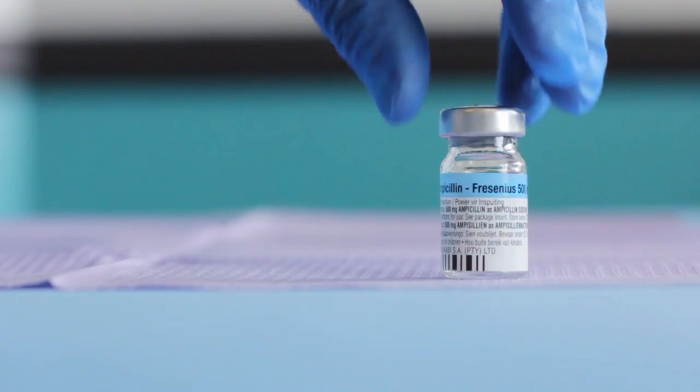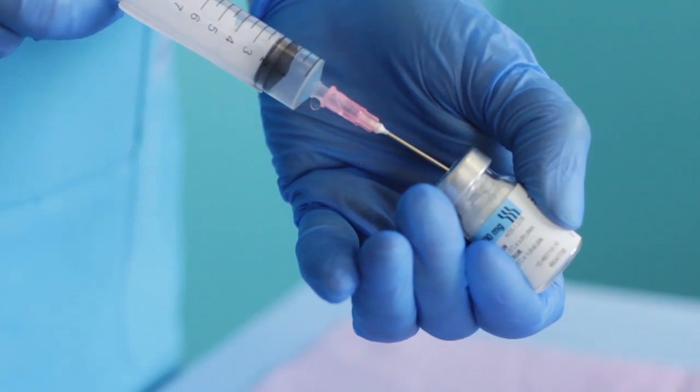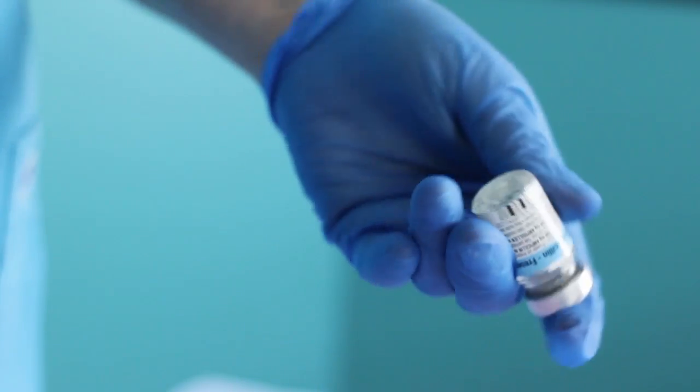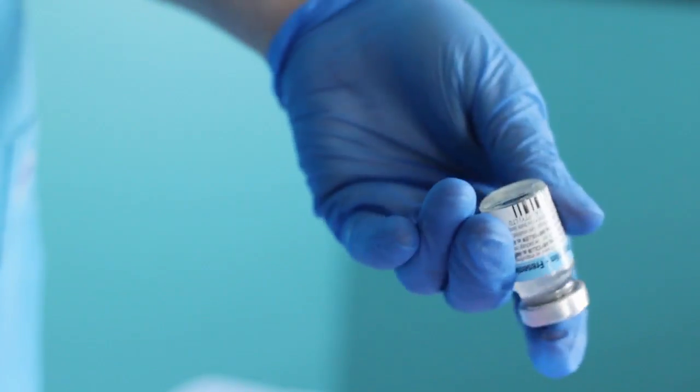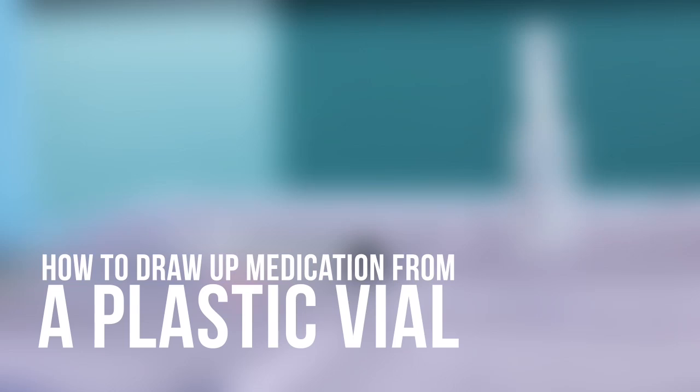Some medications are supplied in a powder form within a glass vial. Use the same steps as above, but first dissolve the powder in an appropriate solvent before drawing the medication.